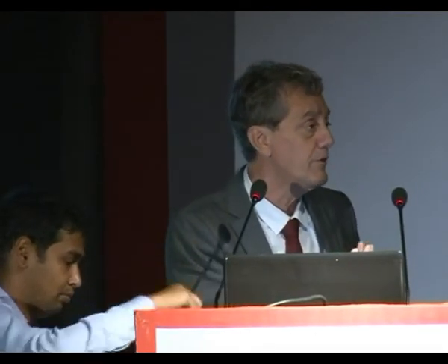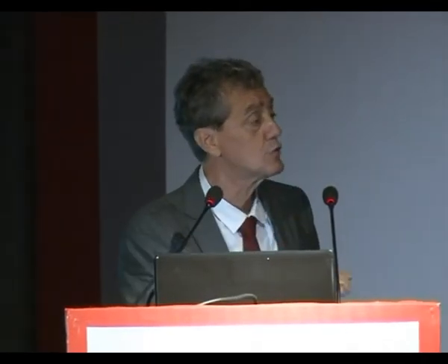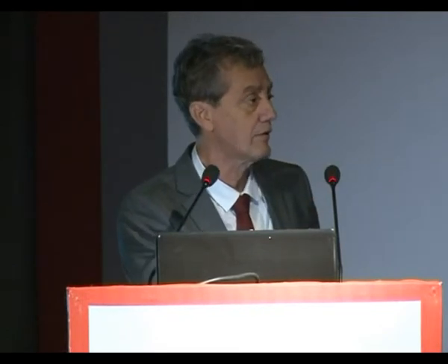It's easier for me than the subgluteal approach on obese patients. Because on obese patients, with the subgluteal approach, you need to see the ischial spine, and then after you need to see the greater trochanter. You can see that, but most of the time you don't see the nerve. So you are doing the puncture blindly, even under ultrasound. Here you have these bone landmarks which are extremely easy to identify.